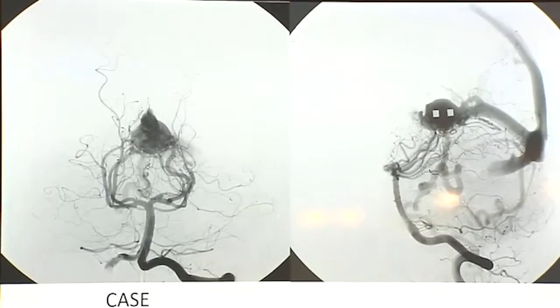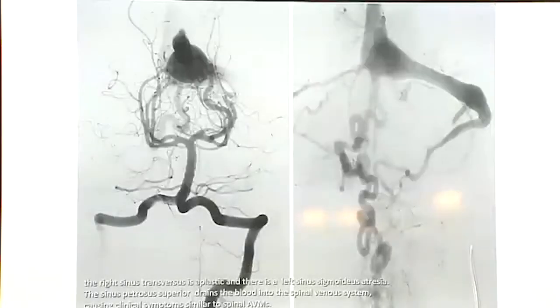This is the next patient with tetraparesis. This young boy, but why tetraparesis? Same situation, closure of the sinus, it is a vein of Galen malformation, and you can see this vein is the same as the dural spinal vein, and this produces the tetraparesis.